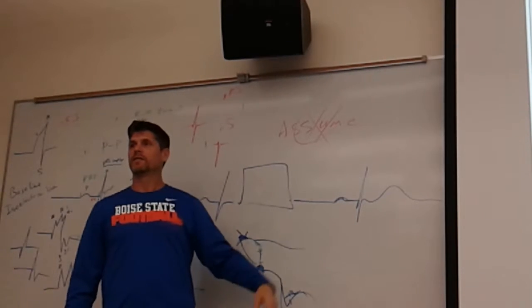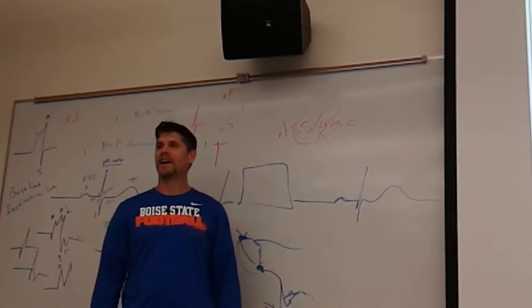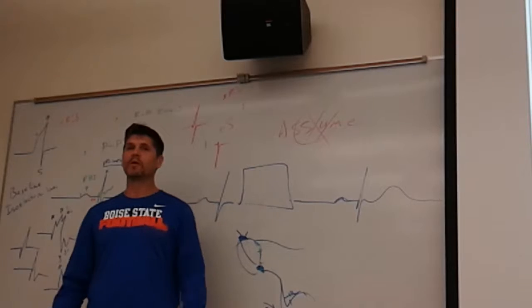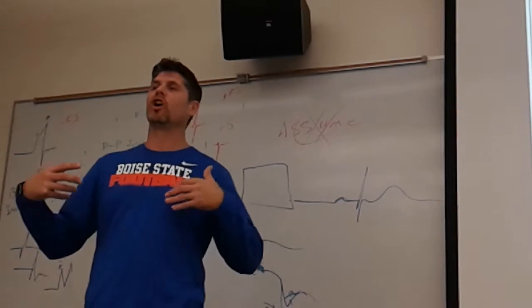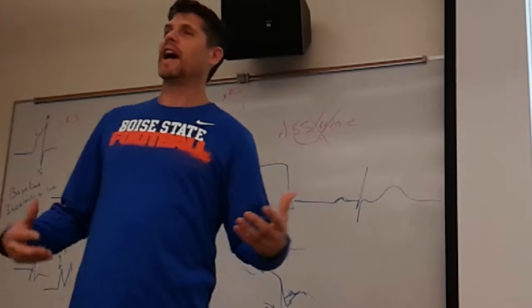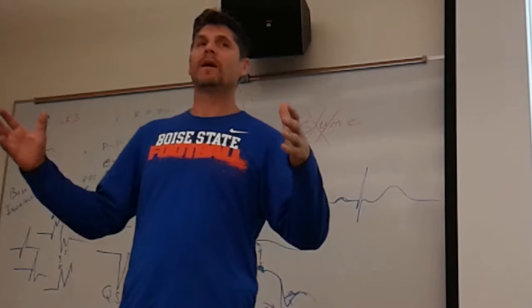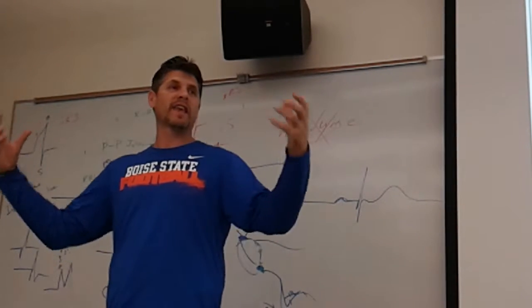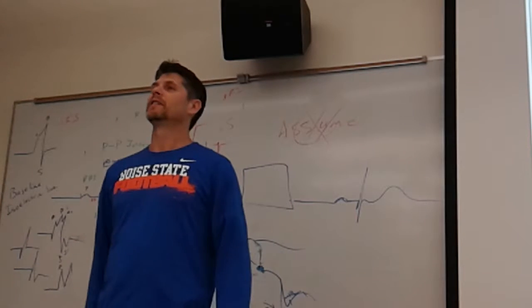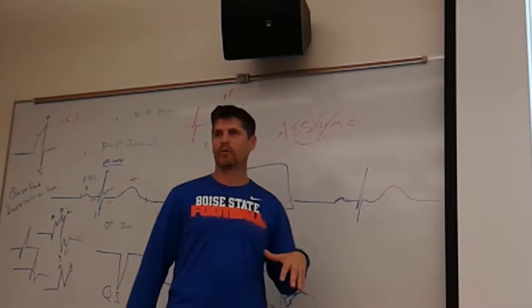Or we misplaced the lead. Or you did something wrong with the lead. Let's assume that that's not the case. We prayed. And we see that something would be wrong in that lead. And so I need you to open up to the idea that these waveforms mean something in relation to the directional flow of electricity compared to where the cameras are. But depending on which camera we look at tells us whether or not it's normal or abnormal.